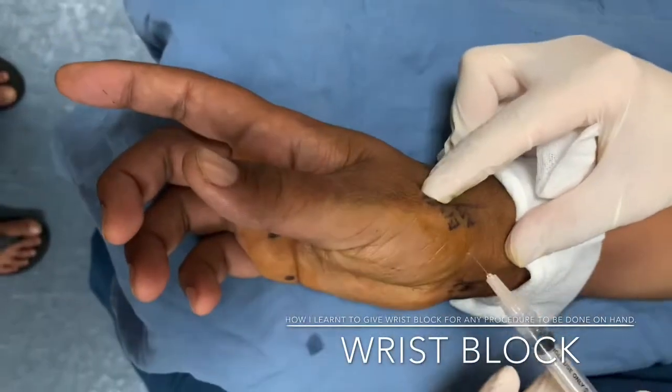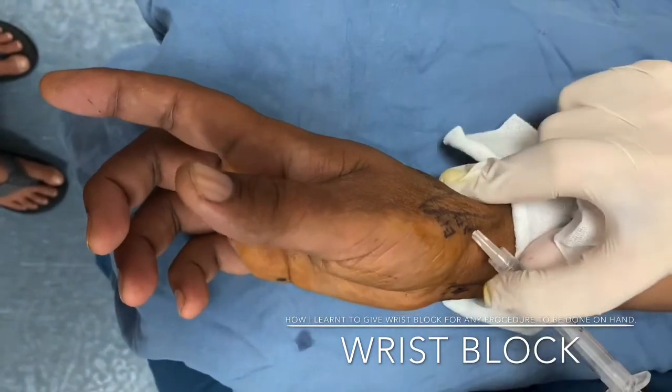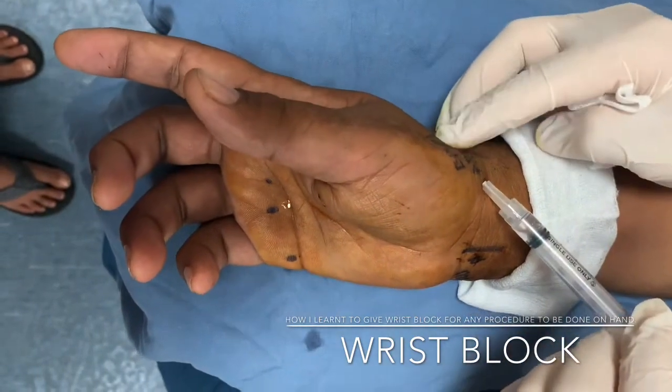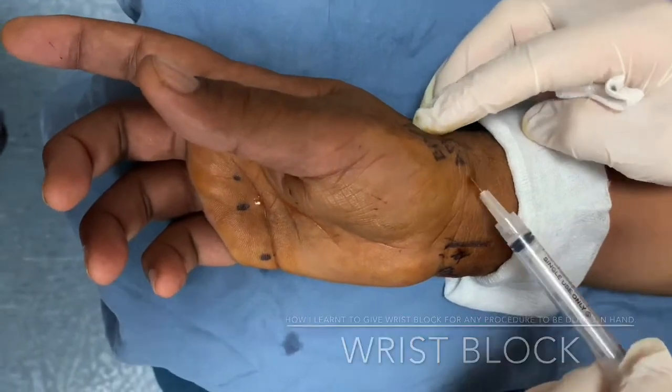Now for the radial nerve, just identify the anatomical snuffbox and give xylocaine here. I usually give four to five cc of xylocaine for each nerve and I have good experience with it. Hope this video will help you — good luck, thank you.